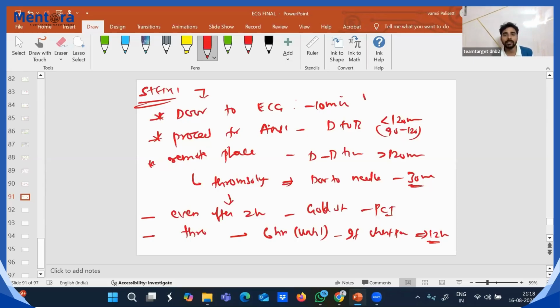They'll ask you a question like this. Here it represents the remote area. They have an ECG showing posterior MI. You are in a remote area. To refer to a cardiology hospital, it takes 3 hours. What is the next step? Yes, you have to thrombolyze the patient. Or you are in some city and a cardiologist is available. What will you do? You will do angiography. Clear?